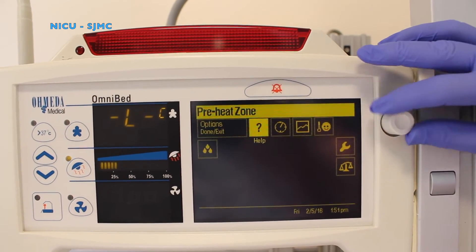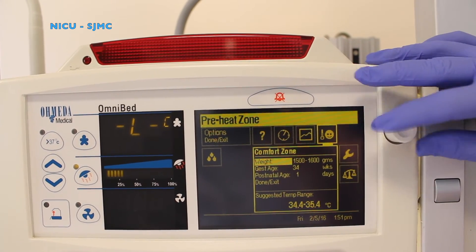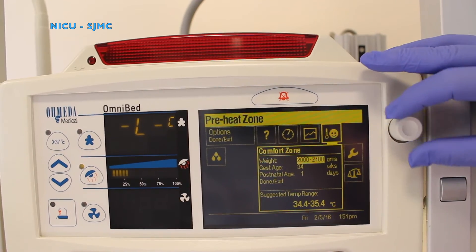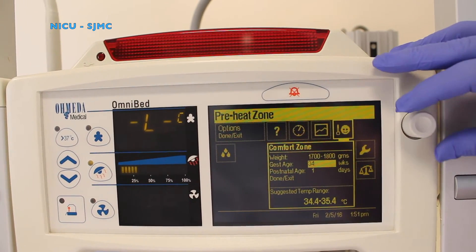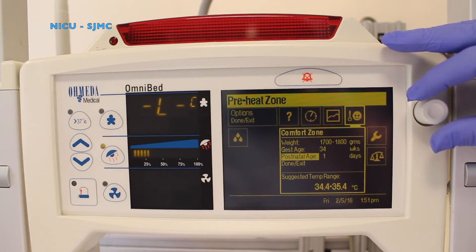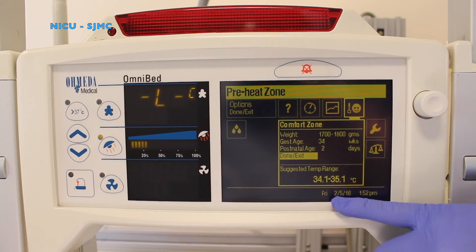To set your temperature for your baby, go to your option for comfort zone. Press it and it's going to give you your baby's weight so you can dial in the baby's weight. For demonstration purposes, we're going to use a 1700 gram baby. Then you dial in your gestational age — for demonstration purposes we're going to choose a 34-week baby. Then you can set the age of your baby, and this will tell you your desired temperature range to start for a neutral thermal environment for this infant.